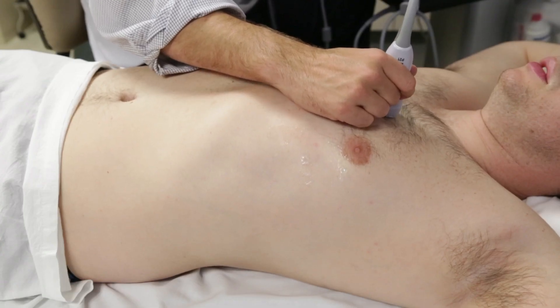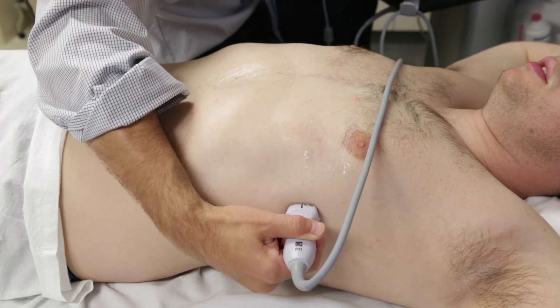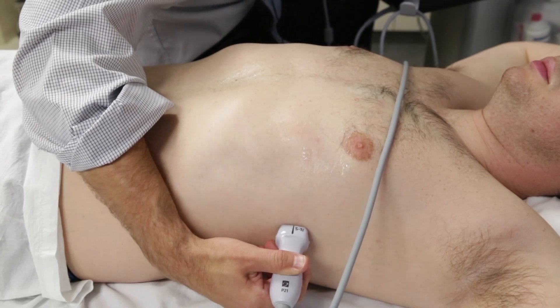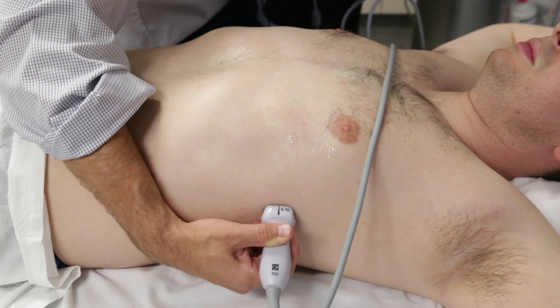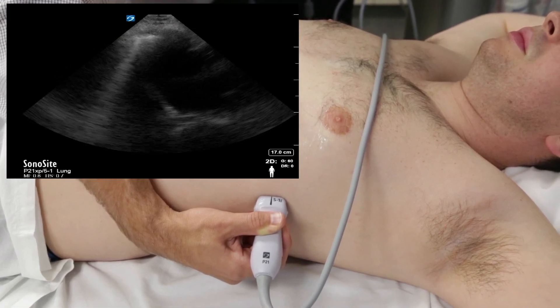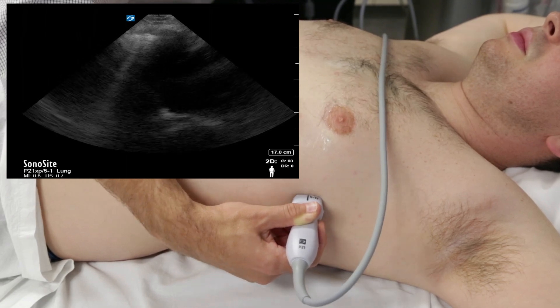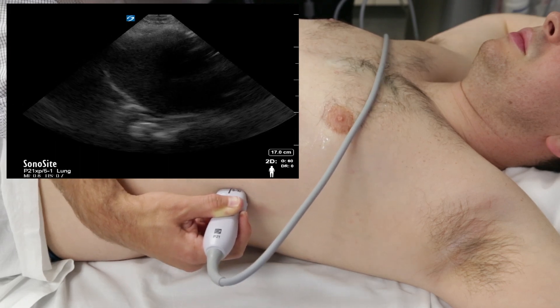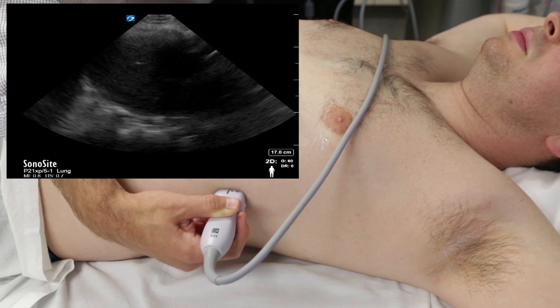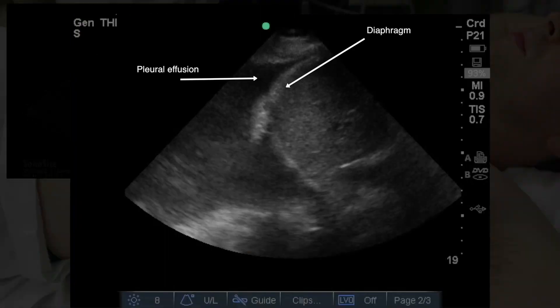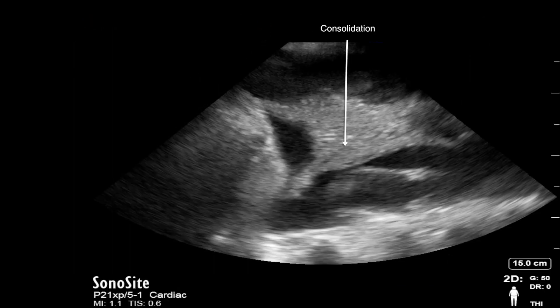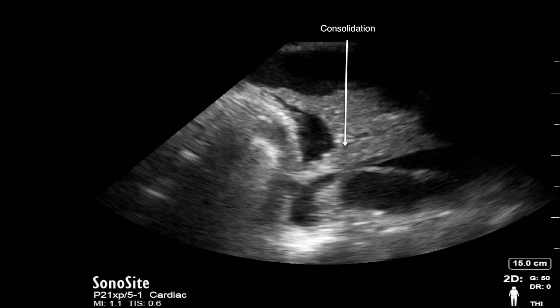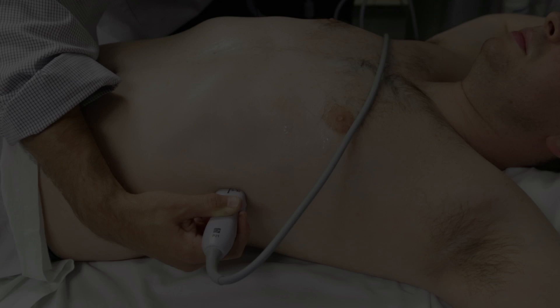For this demonstration, we will move to the posterolateral view next. To obtain this view, the clinician should drop his hand to the bedsheet so that the probe is on the lateral posterior portion of the chest. The probe marker remains cephalad, with the ultrasound beam angled upwards towards the sky. This allows for additional imaging of the posterior diaphragm and identification of pleural fluid. You may also move up or down one or two rib spaces until you identify the diaphragm. This view also provides the ability to identify areas of consolidation or hepatization of the lung. Seen here is an example of a simple pleural effusion with an anechoic space of fluid, and consolidation suggesting atelectasis or pneumonia.